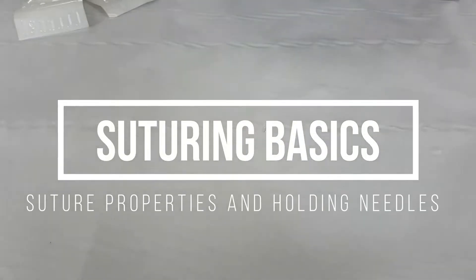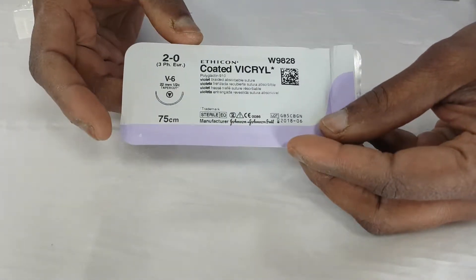So today we're going to have a look at stitches and the different types of stitches that we can get. Some are going to be absorbable, like this stitch called Vicryl.